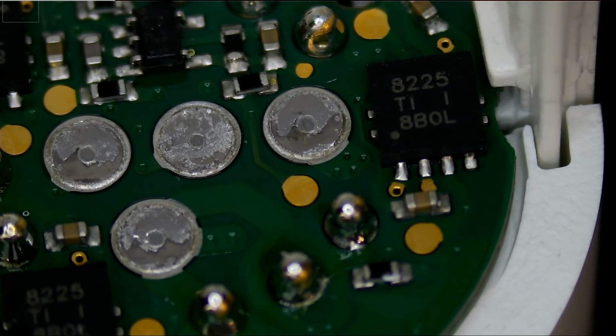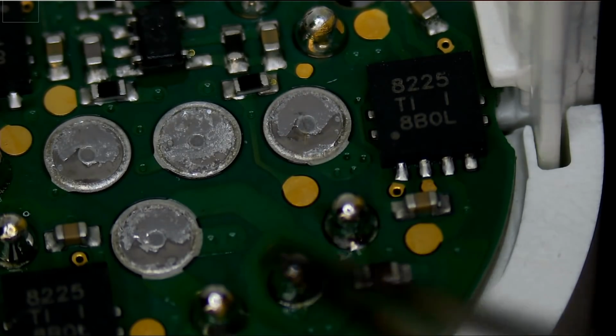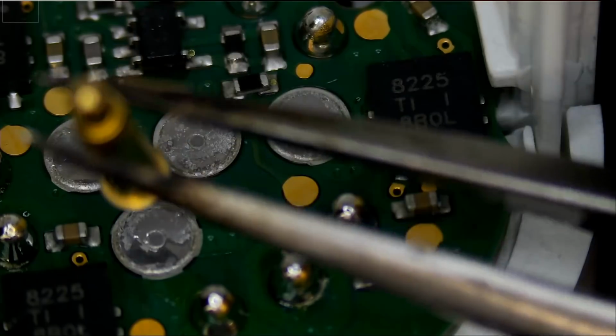Several ways we can do this. We're not going to be using hot air because we do not want to damage any of the plastic around, or anything on the board. So we're not going to use hot air. We have 2 options. We can use our soldering iron, or we can use our hot tweezers. But I think I'm going to skip on the hot tweezers for now. I do not know how fragile those pins are.